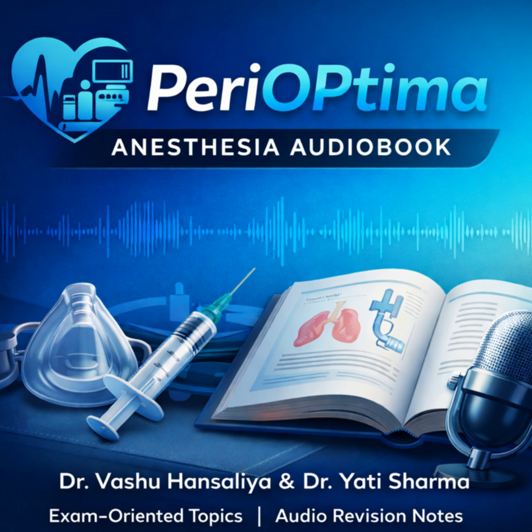And HMEs, while they're good, do have their limits. Of course. The main limitation is that any device in the circuit adds resistance and dead space. A clogged HME can really increase the work of breathing, and you wouldn't use one if the patient has lots of secretions, for instance. You'd need active humidification then. Right. Okay, let's move into what is probably the highest yield section for both exams and clinical practice: errors, artifacts, and troubleshooting.